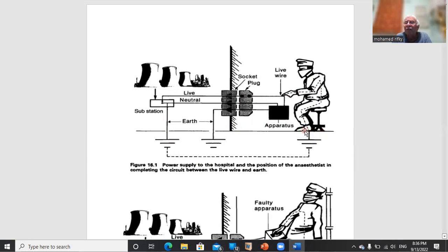Of course, this applies if the person is not wearing proper footwear, and the anti-static properties of the floor are not accomplished. As we said before, we must have a resistance of 75 kilo ohm to 10 mega ohm. This resistance is capable of removing static electricity. The dissipation of static electricity is allowed to pass, but it will prevent current from going easily through the earth.